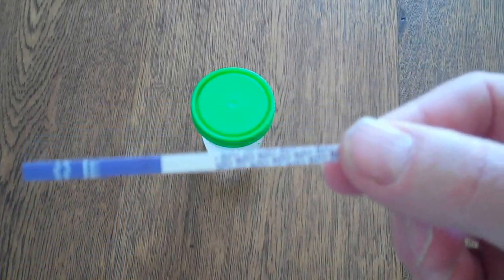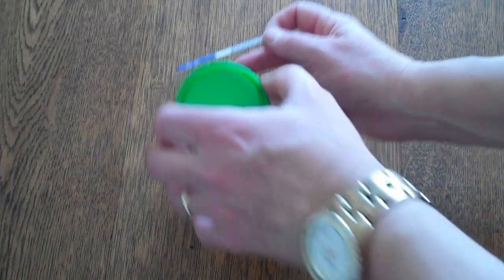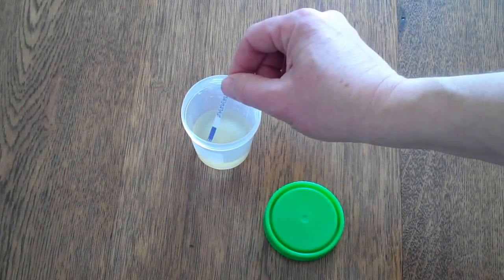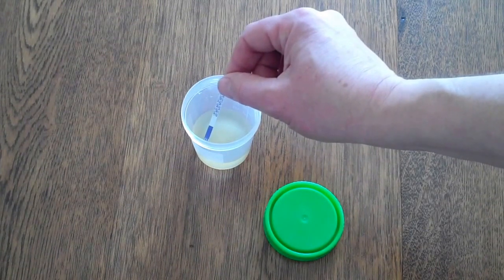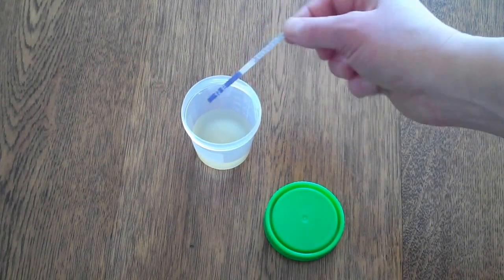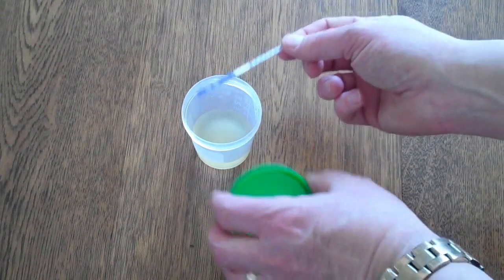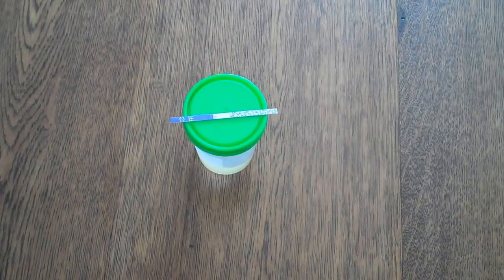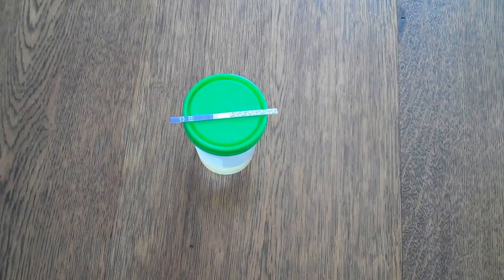So to perform the test when you're ready to do it, all you have to do is to dip the strip to just below the maximum dip line, and you're holding it in the urine sample for between 3 and 5 seconds to absorb adequate urine. As soon as that's occurred, you can remove the test strip from the urine, and then you're laying it on a flat surface or holding it flat for the test to run.